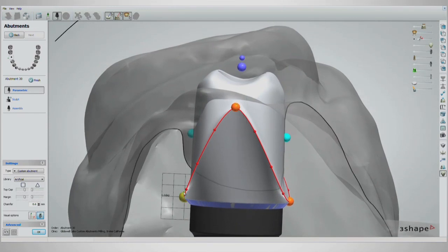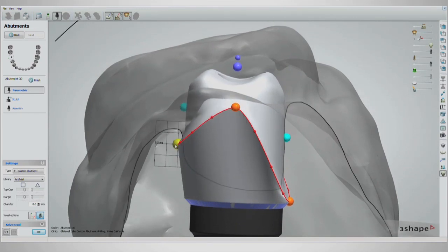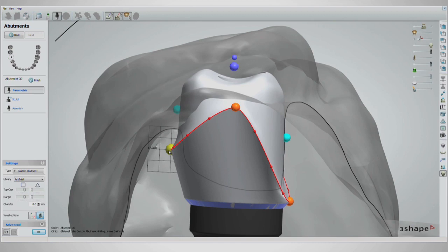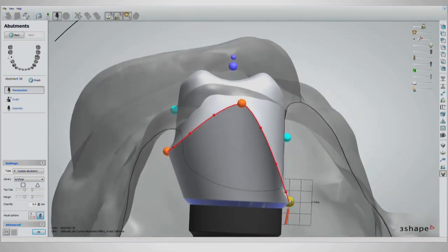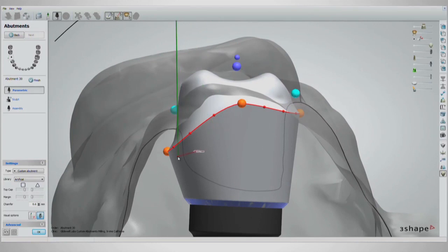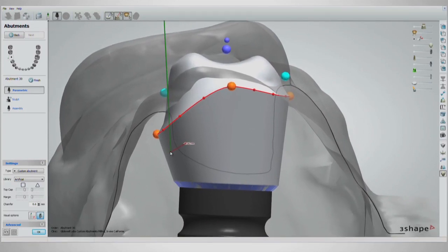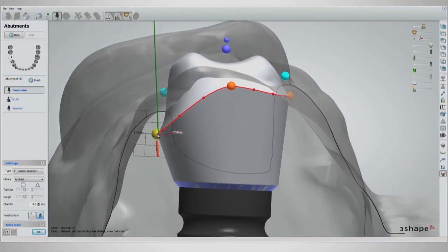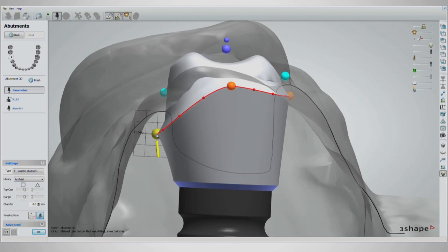Next, move the buccal handle to a millimeter below the tissue and the lingual handle half a millimeter below the tissue. To change the emergence profile, put the cursor on the orange handles and scroll with the mouse wheel.